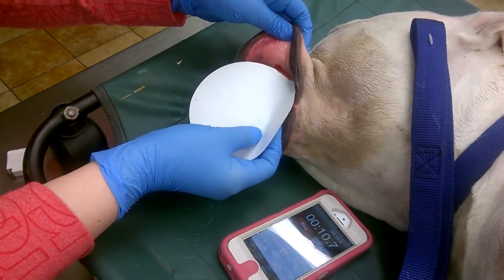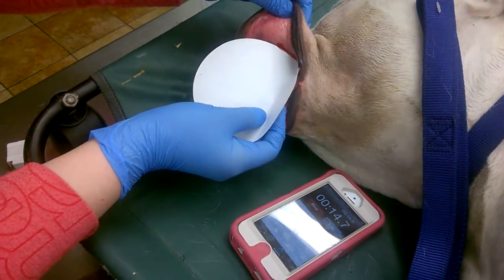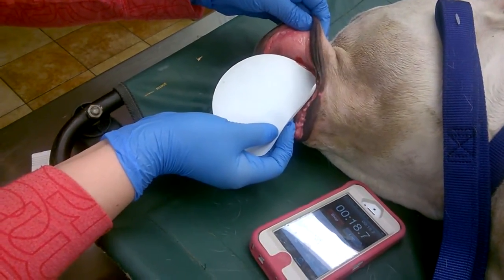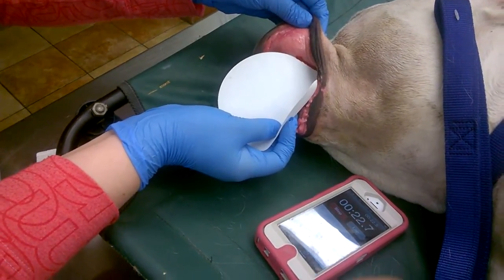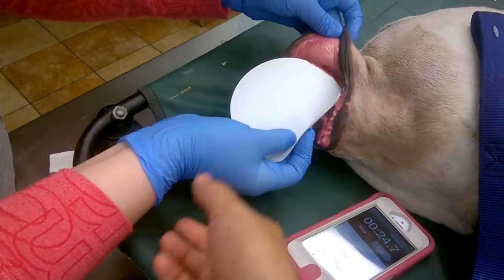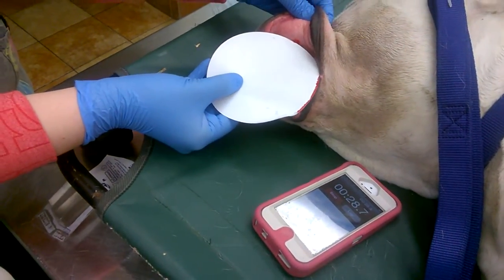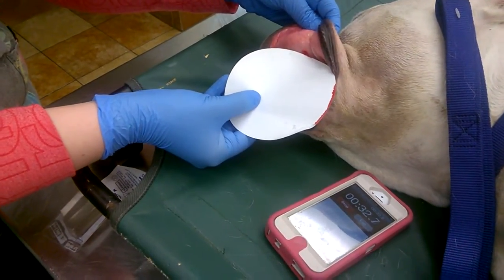Take it away for five seconds — you don't want to touch. Just barely have it against there, and what you're looking for is a thin stream.